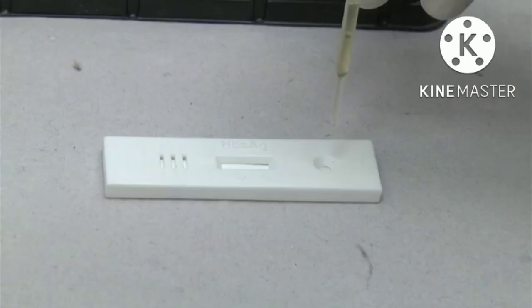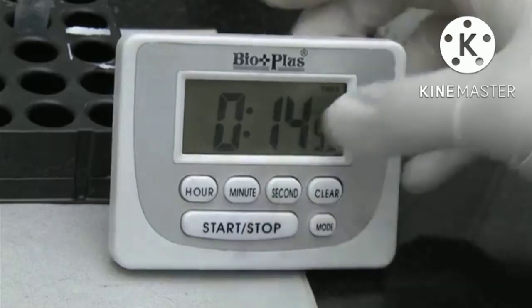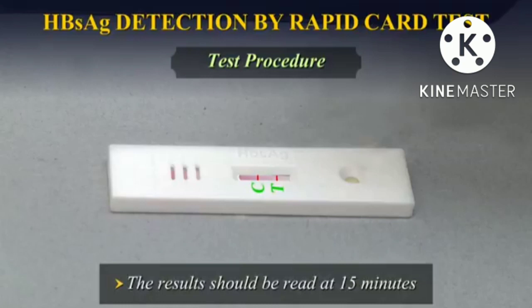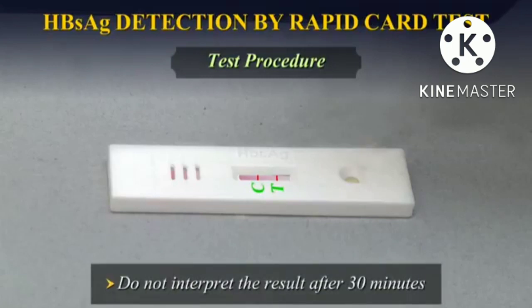Hold the dropper vertically. Transfer 3 drops of serum or plasma to the specimen well of test device and then start the timer. Wait for the colored line to appear. The results should be read at 15 minutes. Do not interpret the result after 30 minutes.